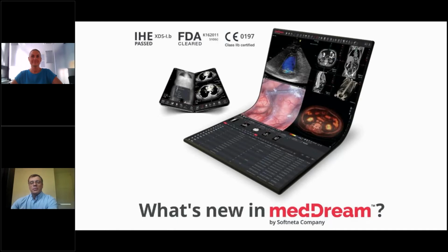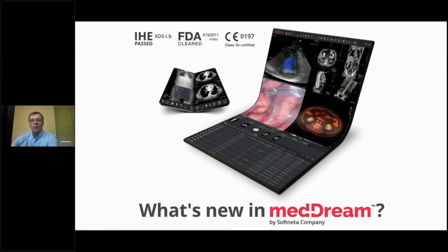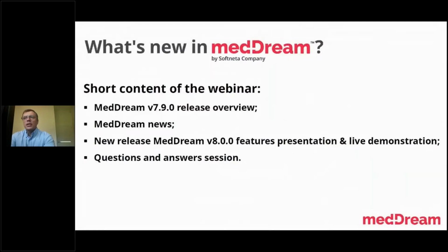So what's new in our MedDream? Today I will start from our latest release. The latest release was also presented last session as potential new features. You could see the functions presented by me in the last presentation, but I will still comment on the most critical features, for everyone to remember what was released a month ago. So, as I explained, in short, we will go over version 7.9. This version was released a month ago.